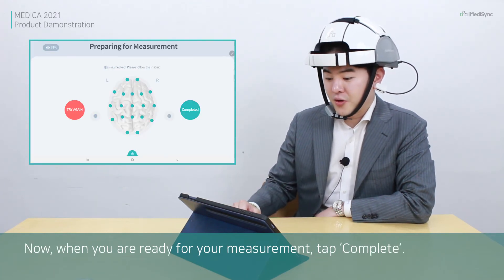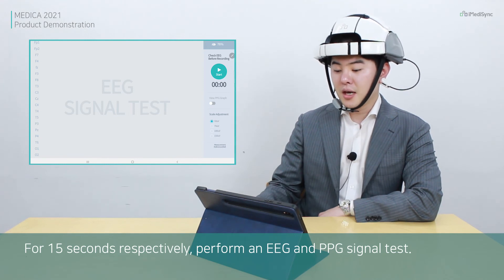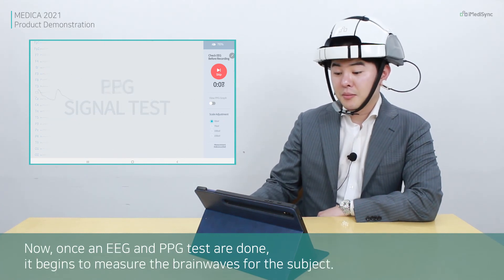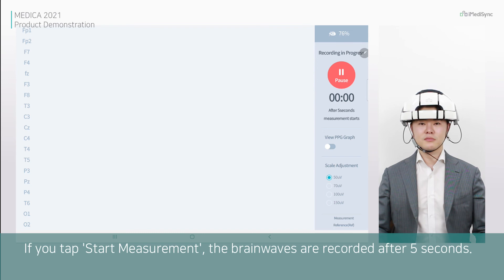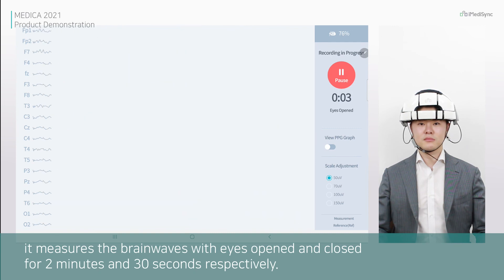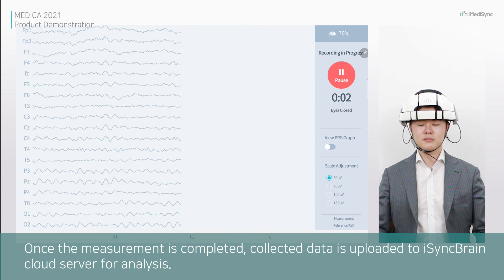When you are ready for measurement, tap complete. For 15 seconds respectively, it performs an EEG and PPG signal test. Once the EEG and PPG test are done, it begins to measure the brainwaves for the subject — 2 minutes and 30 seconds with eyes open and 2 minutes and 30 seconds with eyes closed. Once the measurement is completed, the collected data is uploaded to iSyncWave.